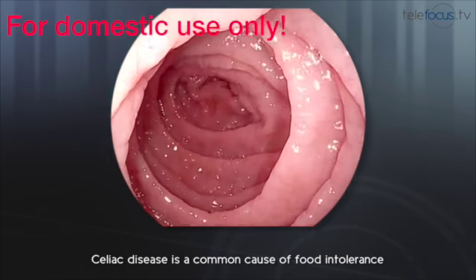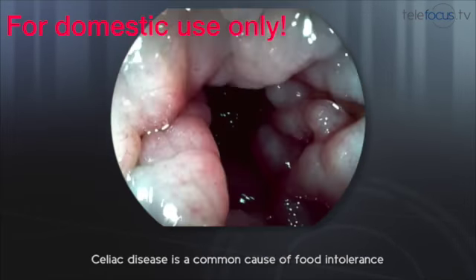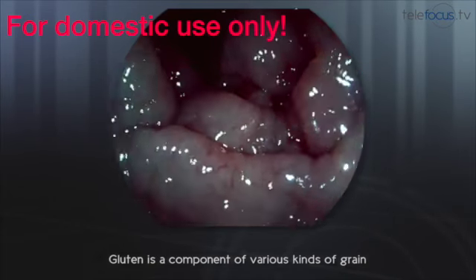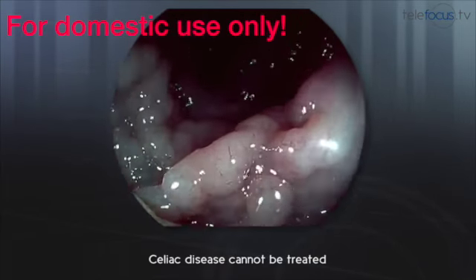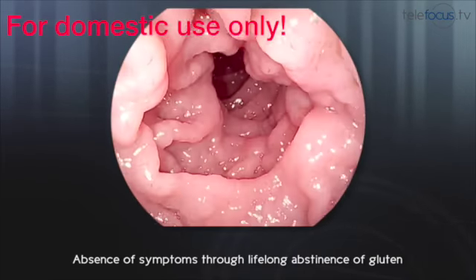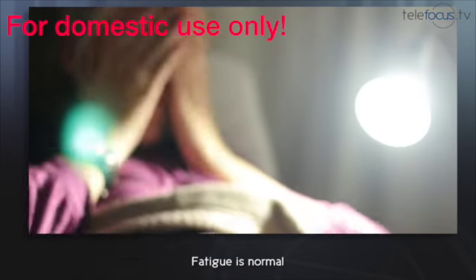A common kind of food intolerance is celiac disease. This is partly a genetically caused intolerance against gluten, which is part of various kinds of grain. It is a chronic disease of the duodenal mucosa that can't be treated causally. Celiac disease can be treated by lifelong abdication of gluten. If celiac disease is suspected, it can be diagnosed by a small bowel tissue sample during endoscopy.